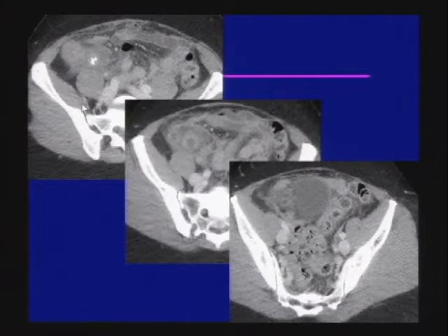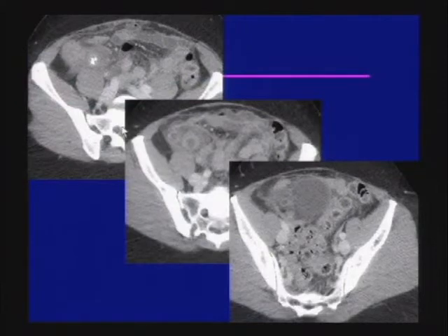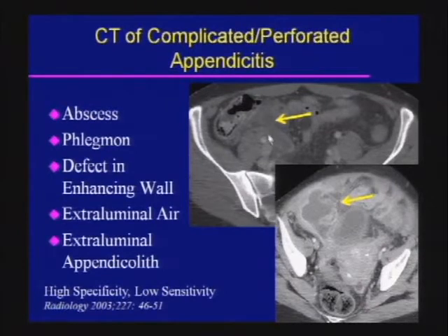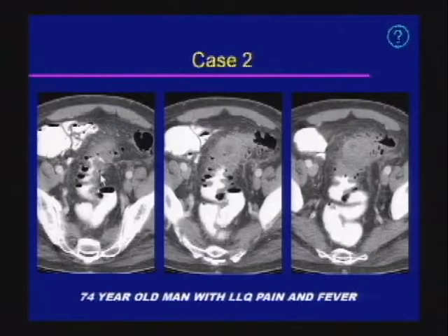In a more complicated case of appendicitis, as it becomes more complex with collections, it may be hard to find the appendix. When there are large collections in the pelvis, these patients often do not go to surgery but rather get drained by interventional radiology. Signs of complicated or perforated appendix include discontinuity of the wall in frank perforation and a rim-enhancing collection consistent with abscess. Multiple findings together increase confidence significantly.